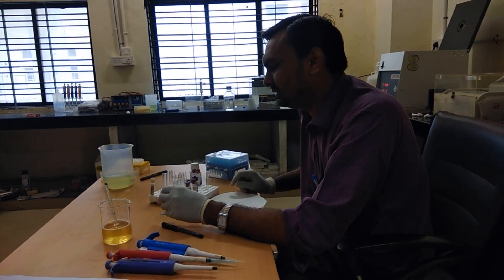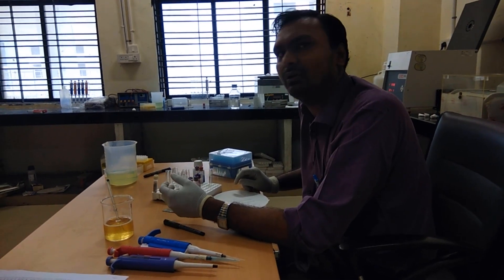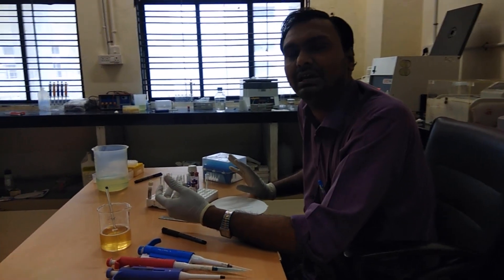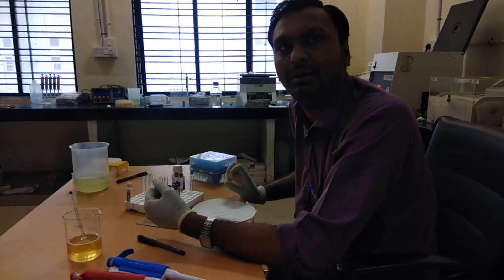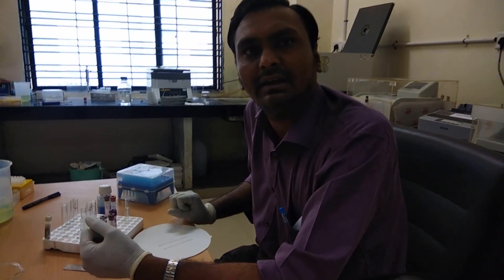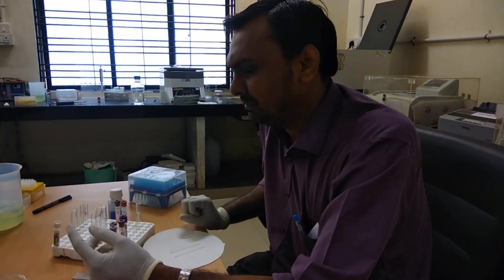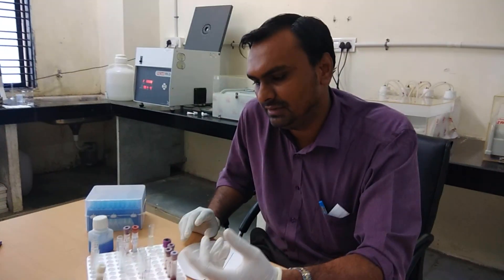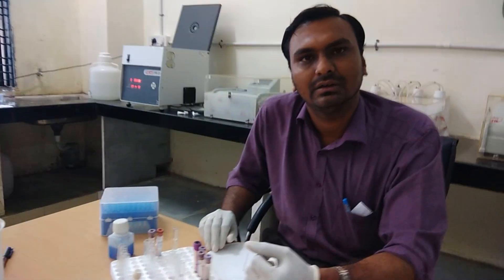Now, whether the person has sickle cell trait or sickle cell disease, we can differentiate with the help of hemoglobin electrophoresis. In a patient with sickle cell trait, the person will have both the A and S bands. While in the case of sickle cell disease, only the HbS band will be present.